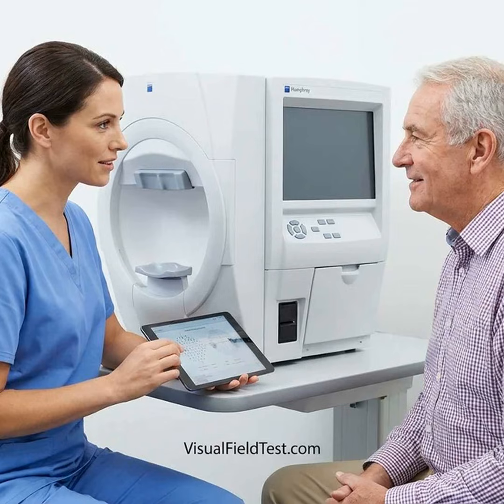The technician should use a consistent script. Instructions that are too strict may cause patients to withhold responses. Instructions that encourage excessive guessing may increase false positive responses. The patient should follow the instructions for the specific instrument and testing algorithm being used.